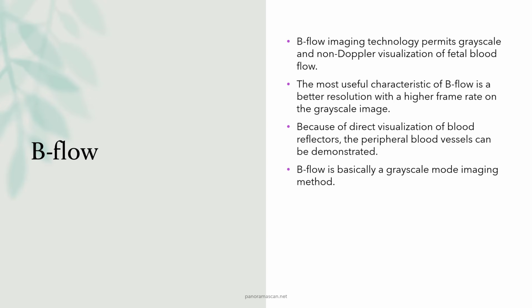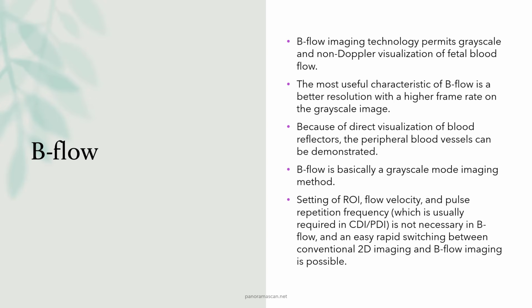With no need for adjustments like velocity, PRF, or flow settings, B-flow simplifies the imaging process. The clinician can quickly switch between conventional 2D imaging and B-flow imaging for both anatomical and blood flow assessments, increasing efficiency and speed during the examination.